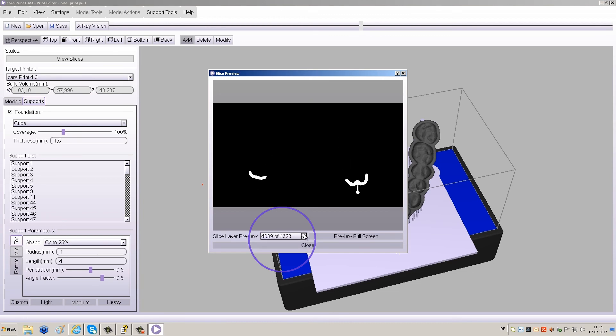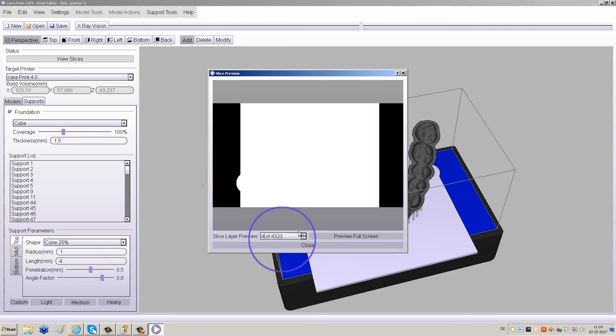If you observe any red areas, place a support there and re-slice. Please note that the red area is only seen in the slice where the initial light curing will start.